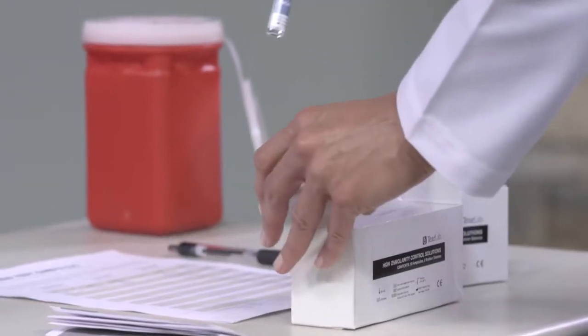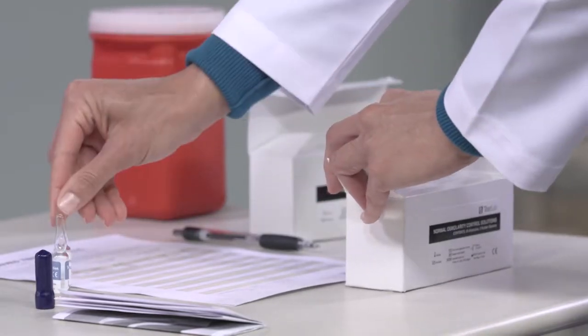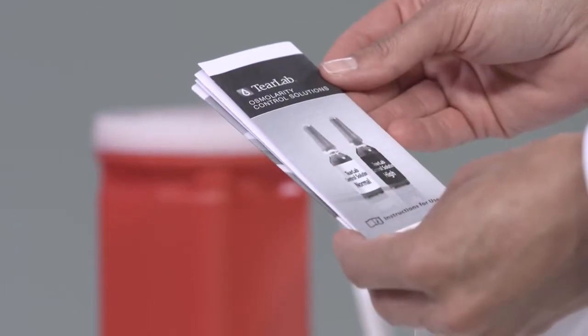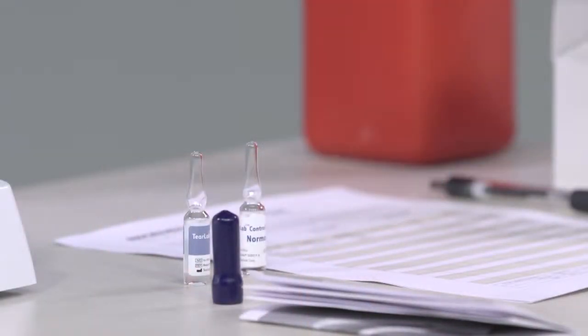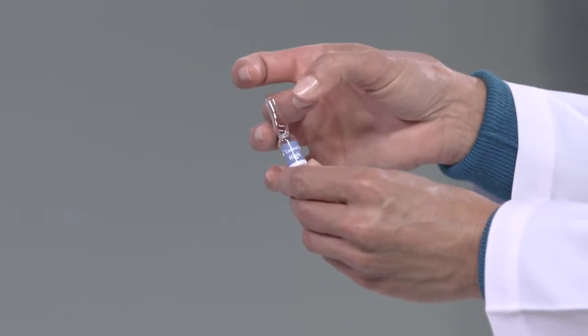Remove one ampoule from the box of high controls and one ampoule from the box of normal controls, along with a blue rubber sleeve. Remove the instructions from the back of either box. Tap the neck of the high control ampoule to remove any excess solution.